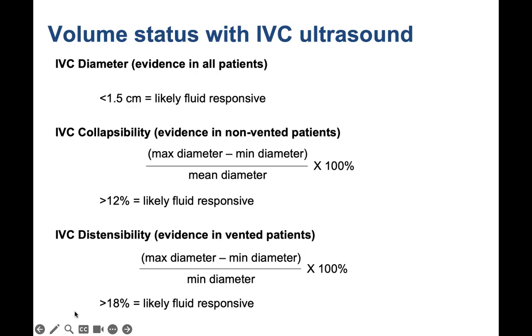So if I'm ever doing these, I usually just look it up, but I honestly don't do it that frequently. But there are some ultrasounds that will actually calculate it for you, and you just have to put in if the patient's intubated or not. And so if I had that ultrasound, I might do it more frequently. So I think it's helpful to know it exists and know how to do it in case you decide you want to.